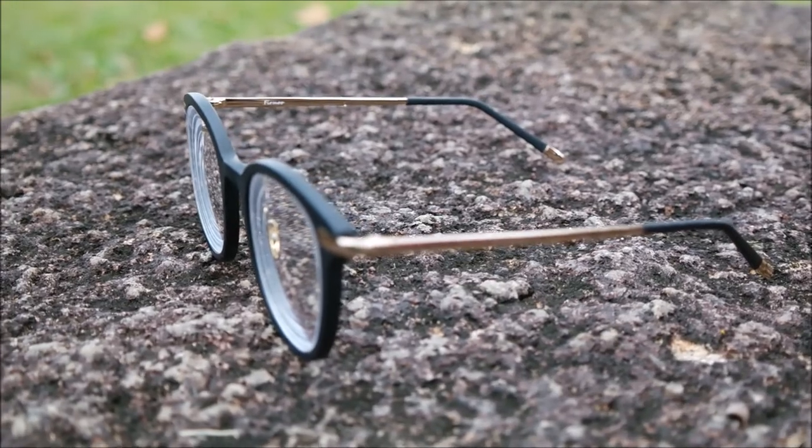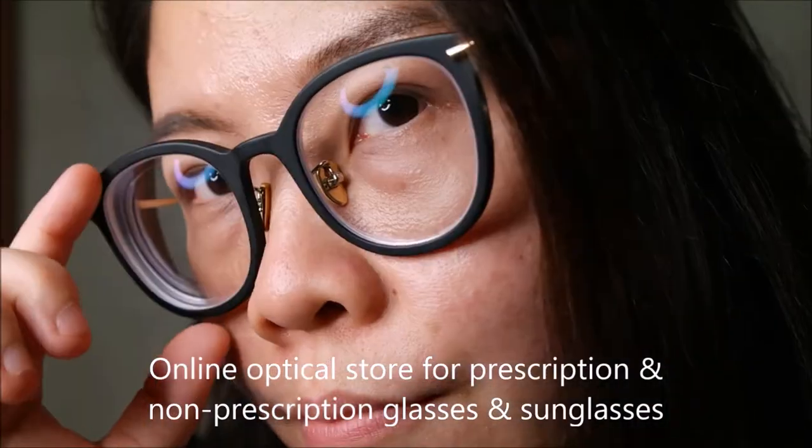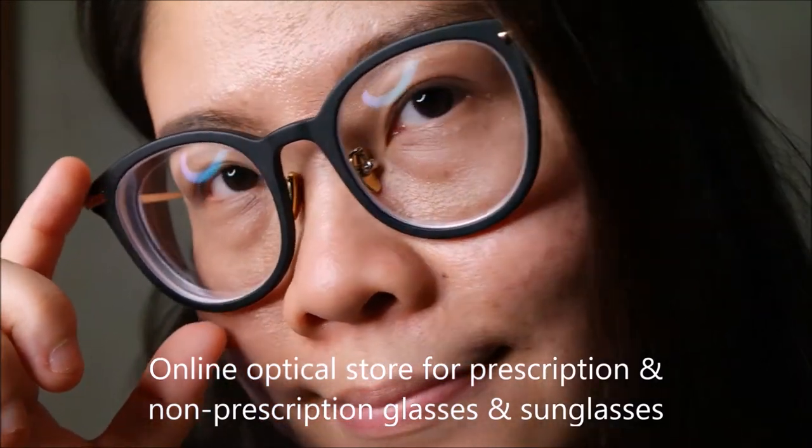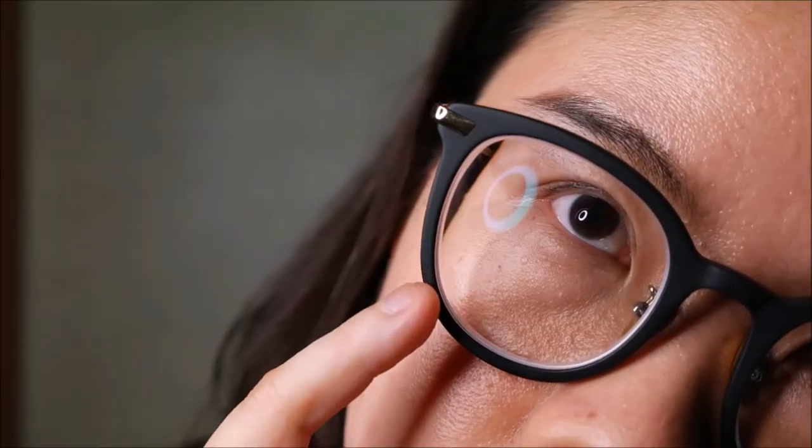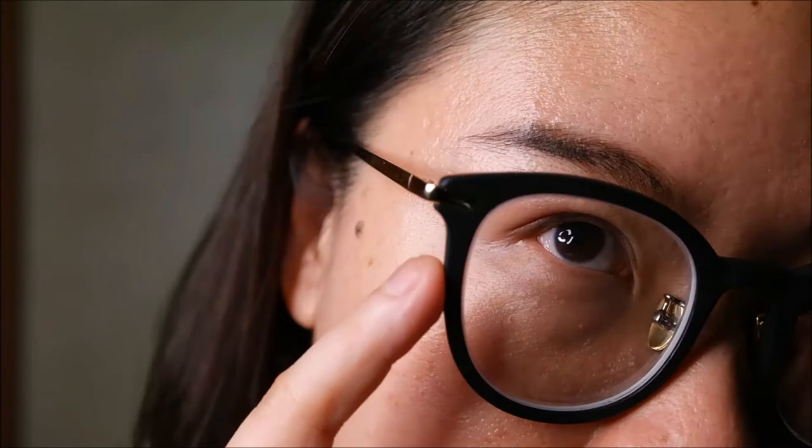Firmoo.com is an online optical store where you can order your prescription glasses and sunglasses through their website and have them delivered to you in just a matter of days. They have contacted me to do a review of their glasses and also to share how my experience of ordering glasses online with them is like.